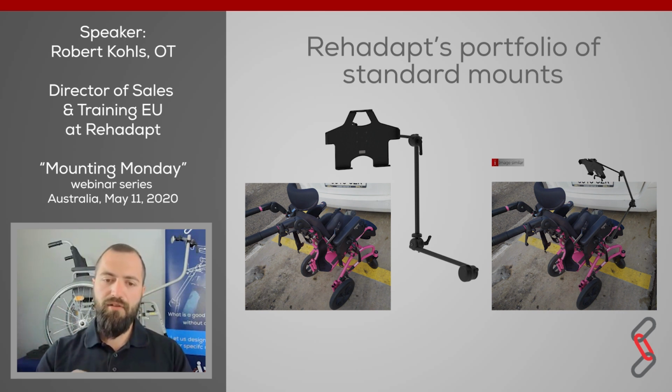And as you can see here and below, the frame has round tubes. They are easy to attach. Normally, we would say it would be extremely easy, when looking at that chair, to use an attaching point here or more here and below on that chair. That could be extremely easy. But as soon as we are tilting the chair, nothing will follow in the direction for the customer.